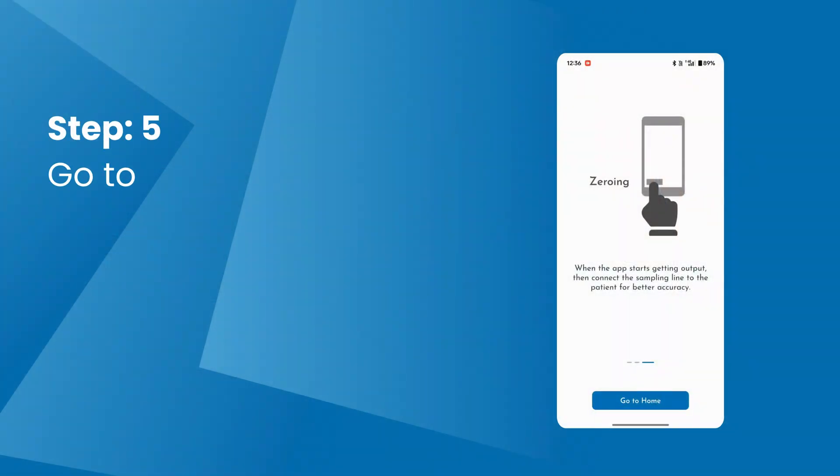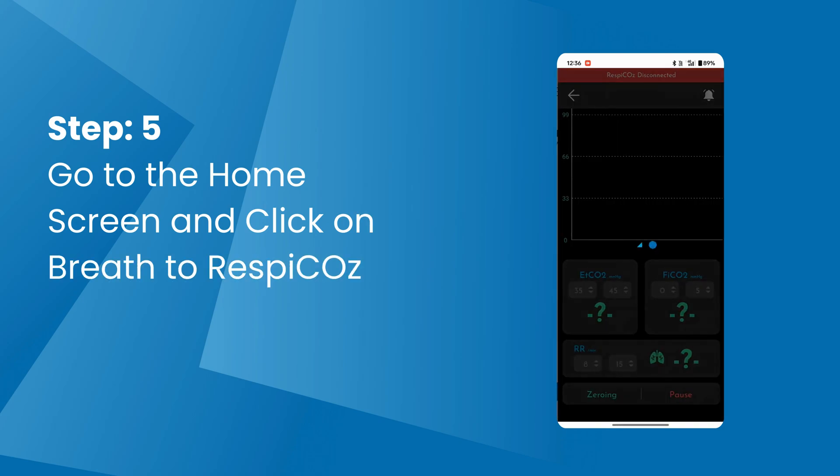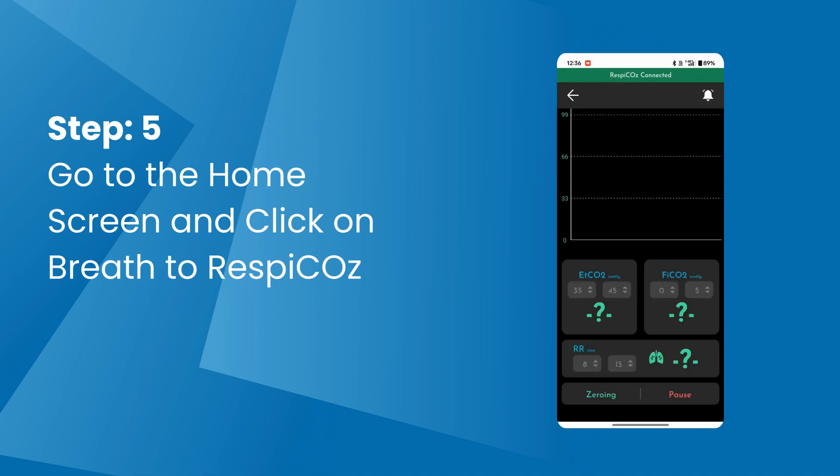Step 5: Go to the app home screen and click on the 'Breathe to Respecos' button. Find your device on the search screen and click on the connect button. Step 6: Your device is now connected with the mobile app.